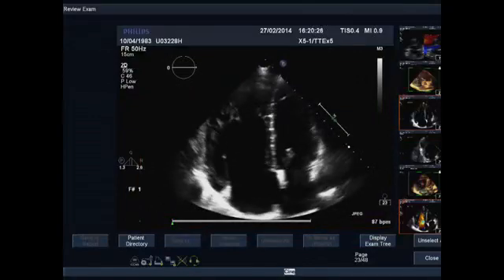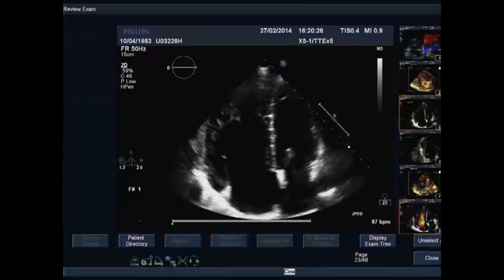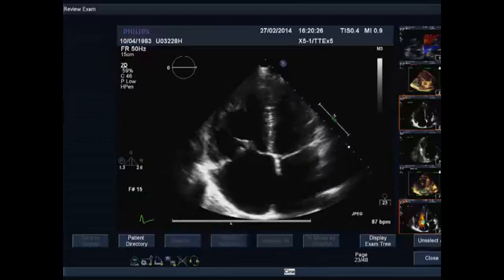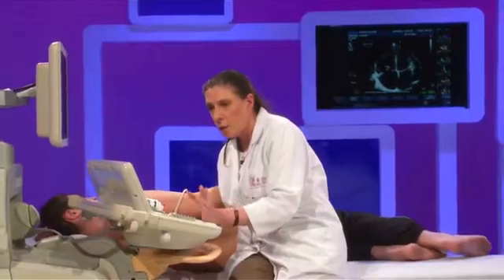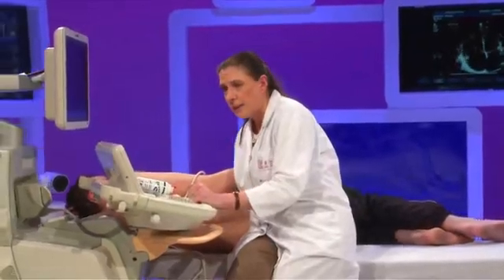So going back, I try to go slowly. What you have to do, you see that the diameter is quite different through the cardiac cycle. What you have to do is to make the measurement of the greatest diameter here. And here I will say that it's close to 3.5 centimeters. It's really borderline, and I can consider that it's too large for a percutaneous closure. So I think that we have assessed the atrial septal defect.